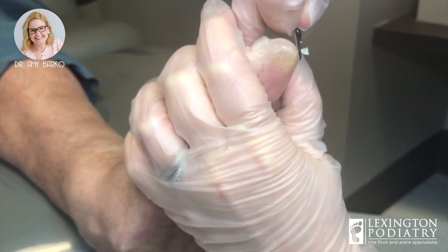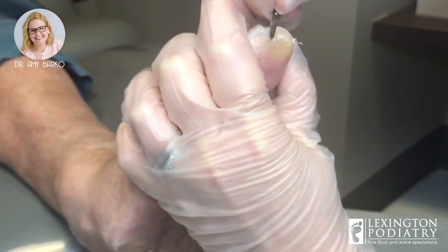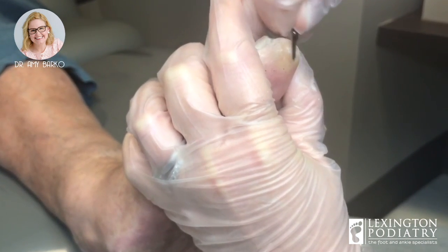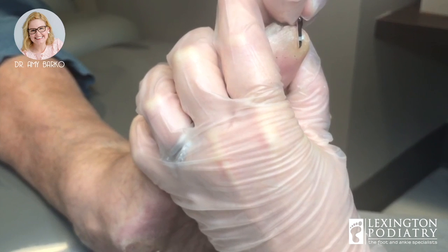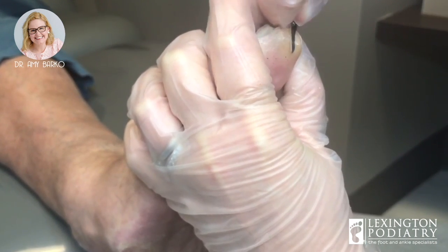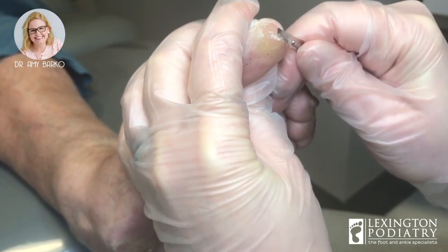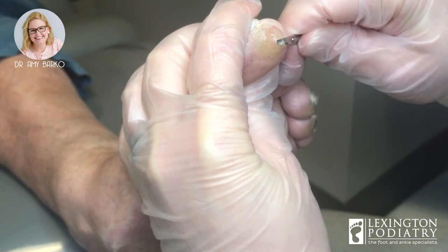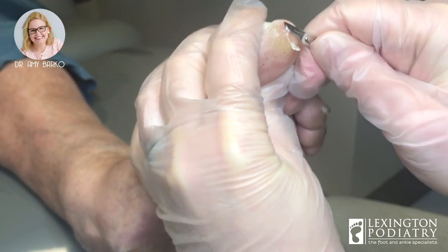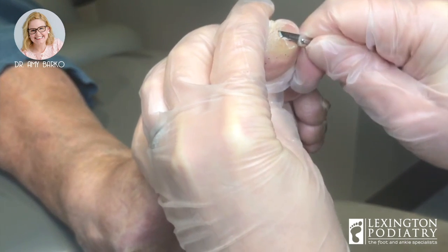When you're trimming calluses, you try to pay attention to the patient's pain. Some patients are very sensitive. I'm very lucky right now — she is not. She lets me do what I need to do. But always pay attention: if your doctor is trimming a callus and it's hurting, just let them know because they can slow down and take a smaller bite, which helps.